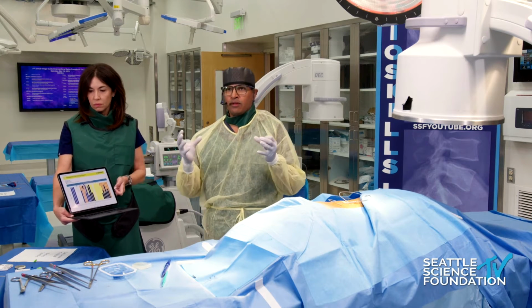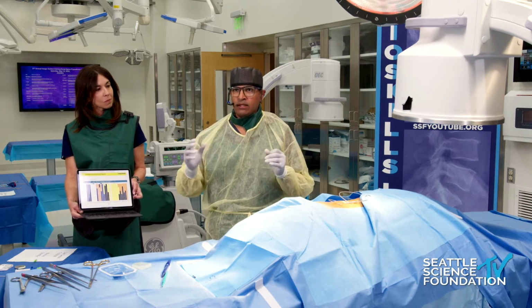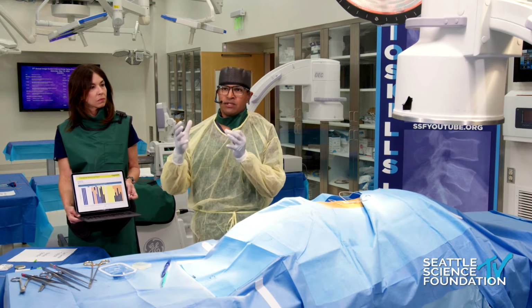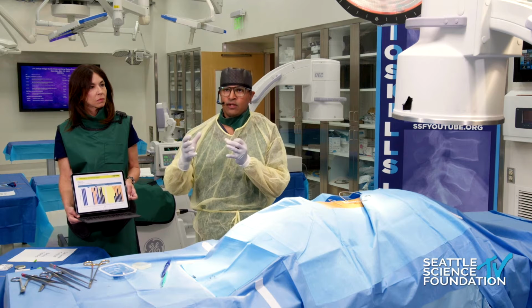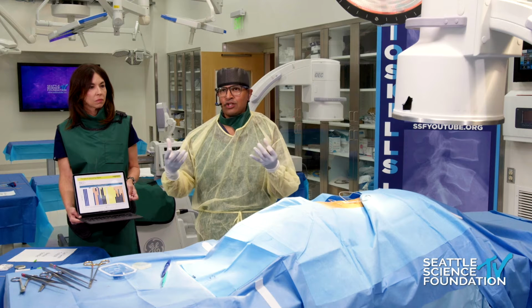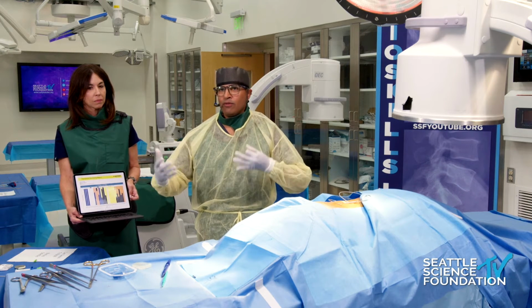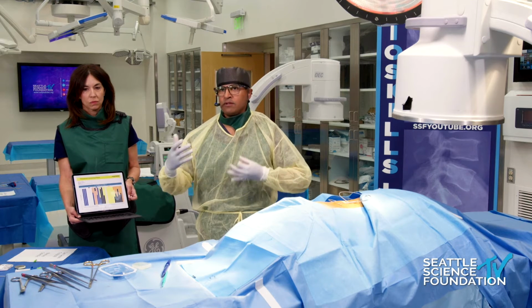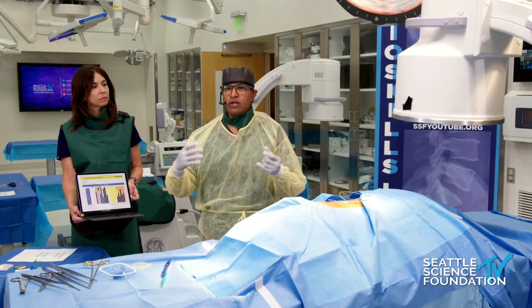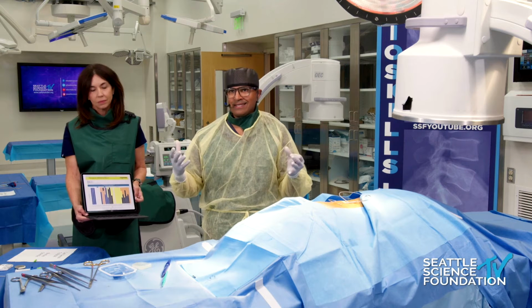So this is what's really cool. The focus here is not just on the implant. Great, we all make our money and we leave and we let the patient go live their life. Now the focus is on what happens in the post-implant period. How can we ensure that the stimulation is working the way we want it to? How can we optimize the therapy so the patient's actually getting the greatest benefit out of it? Because as we know, there's so many different iterations of waveform, cycling, energy use, recharge burden, all these issues. It's complicated. And if we don't know how our patients are doing, we can't adapt and change. So the future really is this.